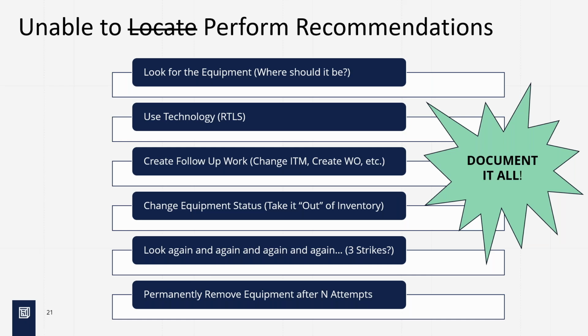Great. And then if we can't find it between the department and the technicians, we have documented that, and then we retire the equipment and disposition the equipment in that process. And we let them know that if they find it, they have to let us know so we can reactivate it and do the PM to go back to an active status. So that's the process. That's how you close the loop. We close the work orders every month.